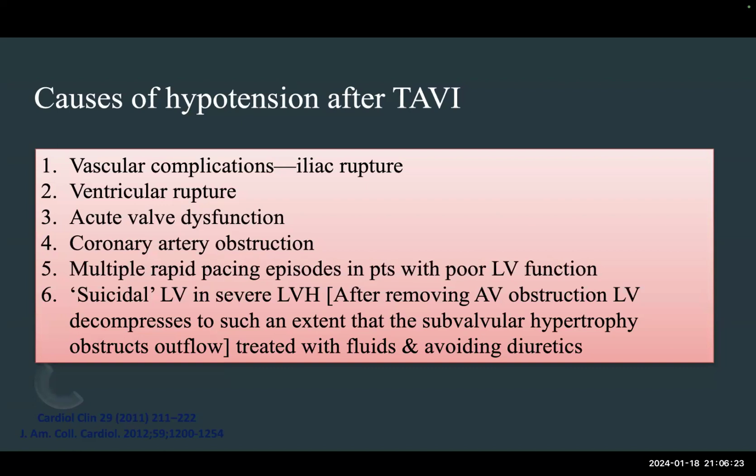Once it is expanding, it's pushing things. When it's pushing things, there might be a thrombus formed in one of these areas, which then causes coronary artery obstruction. Always do an ECG, always. Always do an echo. Always look at the groin. Think about all of these.